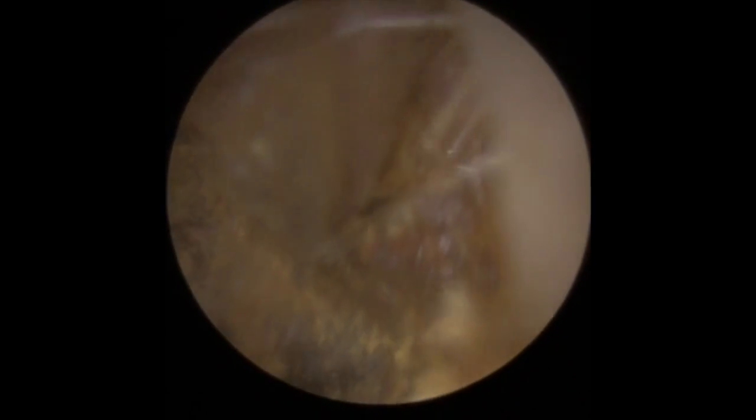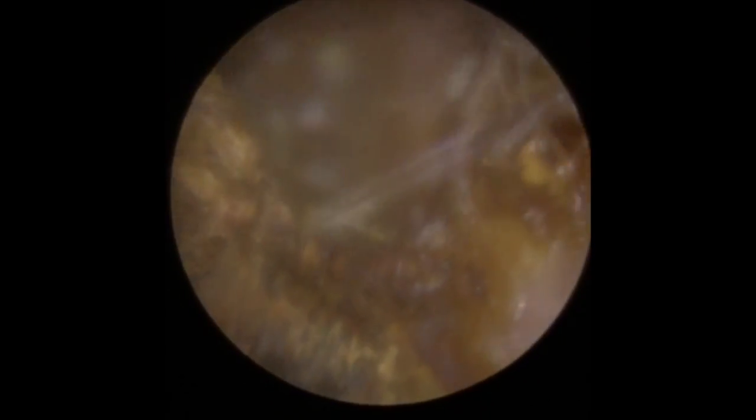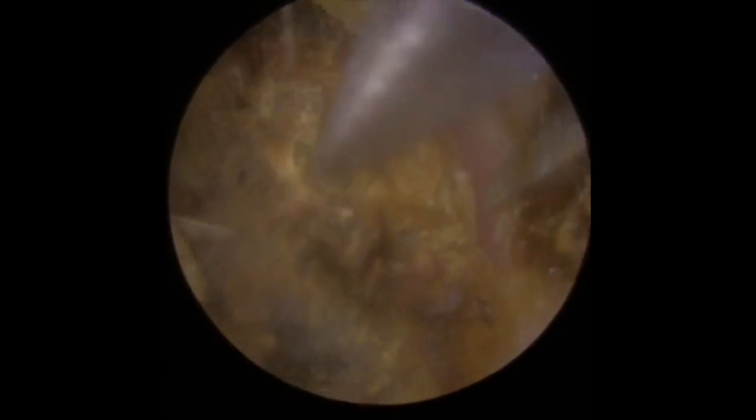I'm going to work on the right side because that's the more prominent side — flexing that, you can see just how tough this is. It's really bound together, held together really firmly. So I'm just using the right side there, bending it in, detaching it from the canal wall, just to give me enough space so I can get the crocodile forceps in here. Just lifting with the bottom edge there — moving. Managed to hold it all together and take it out in one piece.